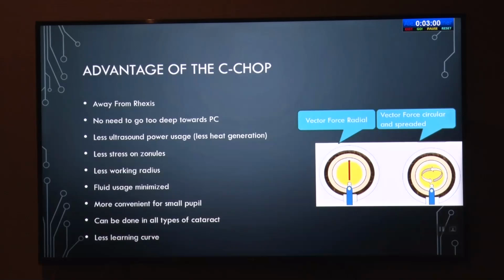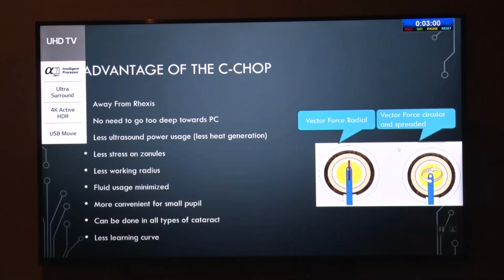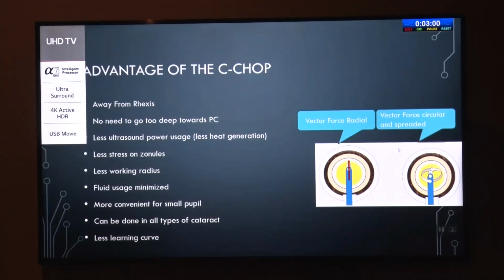So the advantages of this C-chop is it is always away from the rhexis. There is no need to go deep towards the PC. It uses less ultrasound power, less heat generation, there is less stress on the zonules, less working radius, and fluid usage is minimized. More convenient for small pupils, can be done in all types of cataracts, even pseudoexfoliation cases, and it has a lesser learning curve. So we can adapt from stop and chop technique to this technique for beginners and even for experienced surgeons.